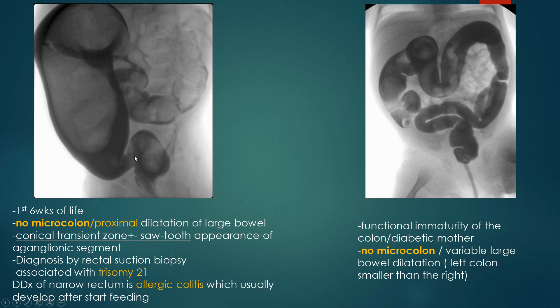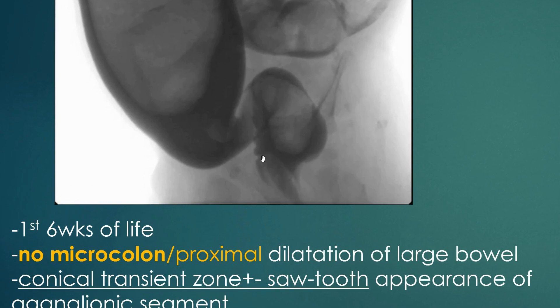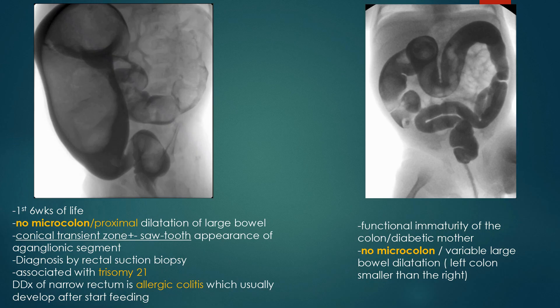In Hirschsprung's disease, we see a reversed rectosigmoid ratio — the rectum is much smaller than the sigmoid, which is the reverse of normal. We can also see a transitional zone between the small and dilated segment, and if we zoom in, we can see the sawtooth appearance in the aganglionic segment.